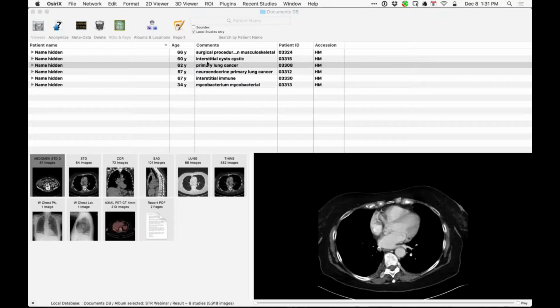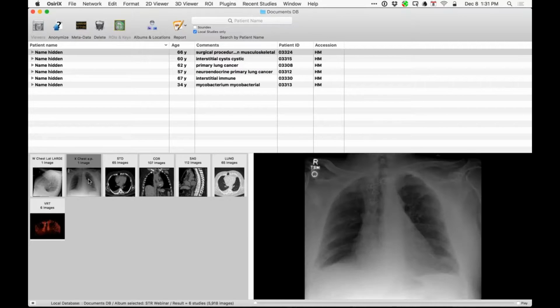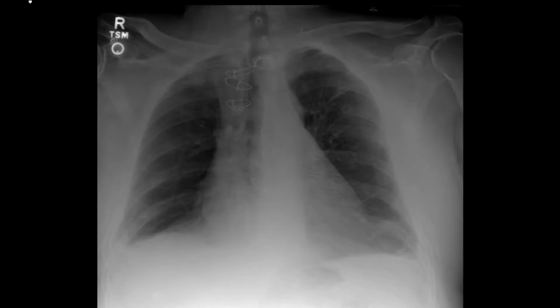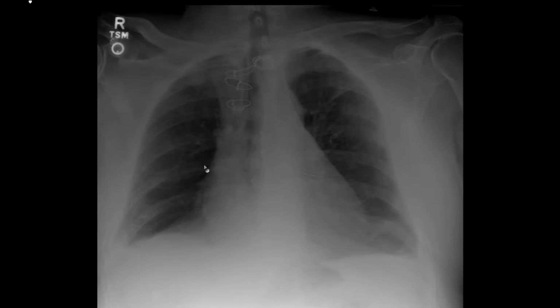Okay, I'll start off with this case. This is a radiograph on a person that is 5 days out from surgery, maybe 4 days out from surgery. So he had a CABG. He obviously has had his left atrial appendage clipped. But this is a pretty dramatic case because we typically don't see this so soon after surgery.